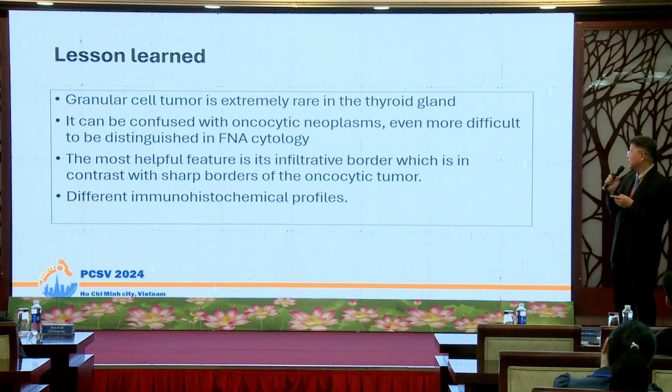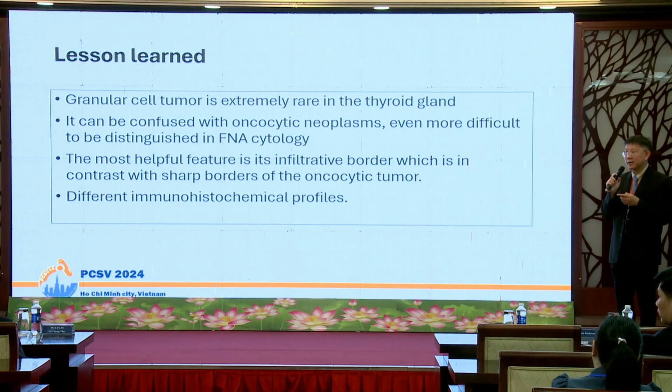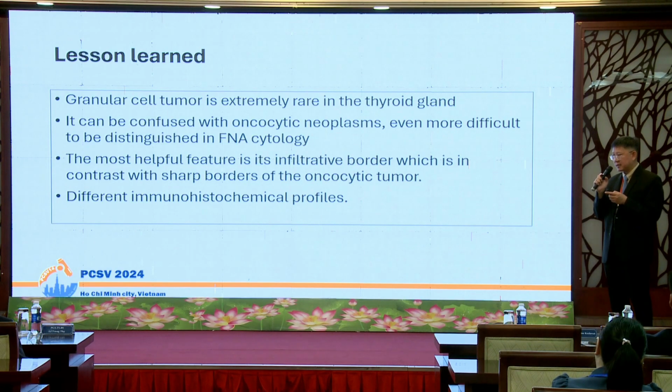This is common. So the most helpful feature that makes you think of this tumor, aside from oncocytic tumor of the thyroid gland, is the infiltrative border.